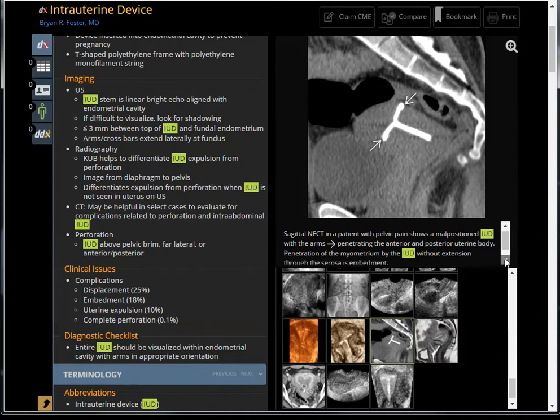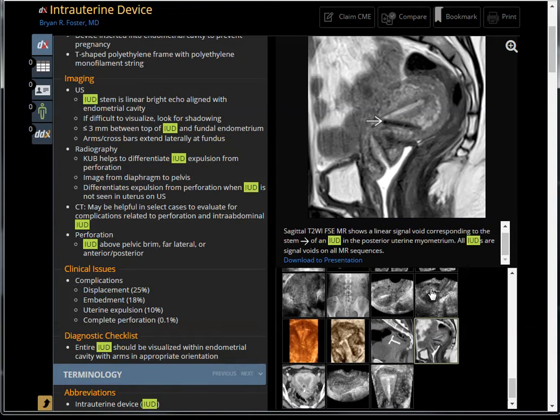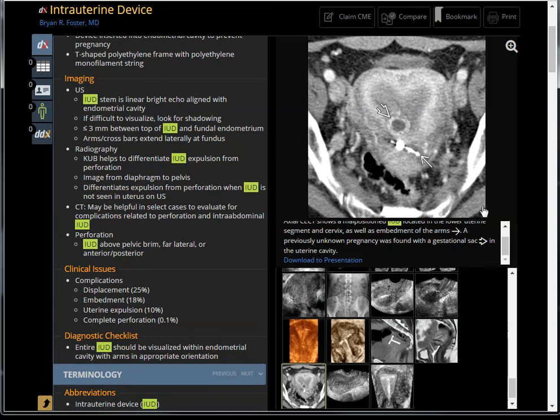They literally embed into the myometrium. If they did not go through the serosa, that's not a complete perforation. Another case of embedment on MRI — you can see a retroverted uterus with the IUD in the myometrium. This case shows malposition of the IUD in the lower uterine segment — probably the copper one. It didn't work because there's a gestational sac right next to it. Unfortunately, this gestational sac is not very safe because a CT scan was performed, and the CT radiation may not be beneficial for this fetus.